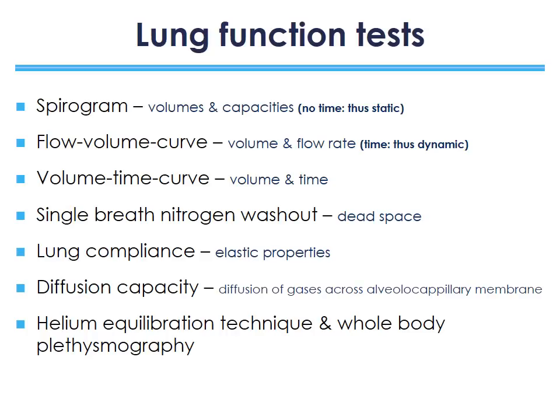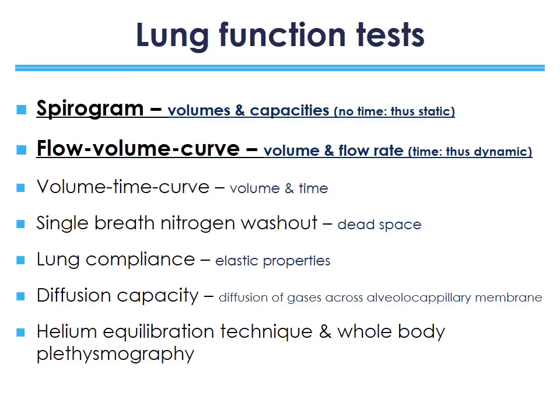There are a variety of lung function tests which can be used for a range of purposes to test specific lung functionality. But the specific two lung function tests that we will be focusing on for the purpose of this practical are the spirogram and the flow volume curve. So the spirogram measures lung volumes and lung capacities. Because there are no time-dependent measurements being taken by the spirogram, we say that the measurements taken by the spirogram are static.